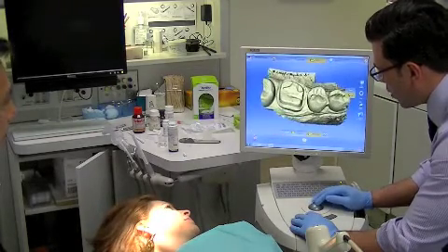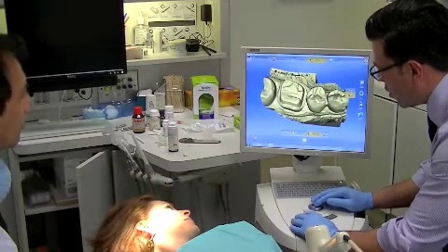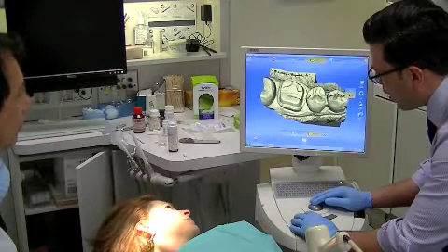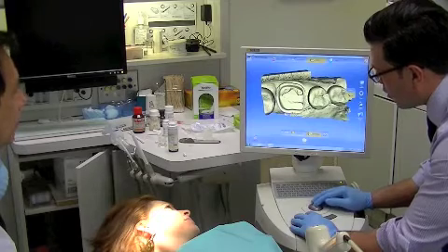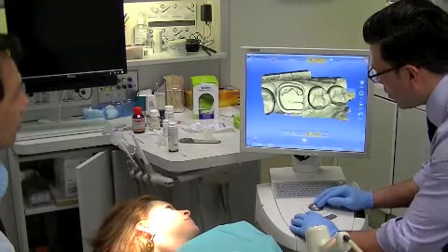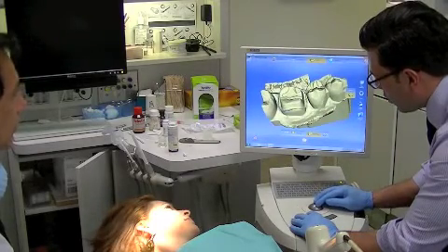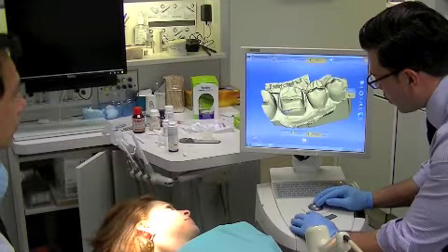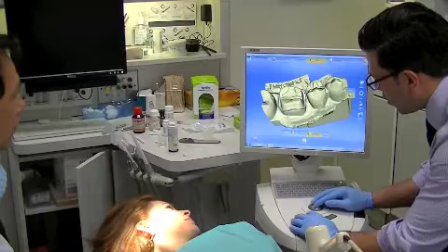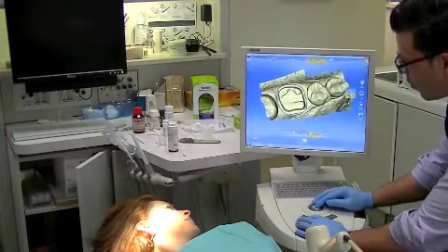Now we're virtually articulated. Now what we're going to do is look here — looks good. What we're going to do is trace our margin. Double click, auto margin finder, and we'll wrap it right around. Now you can see our margin is traced.